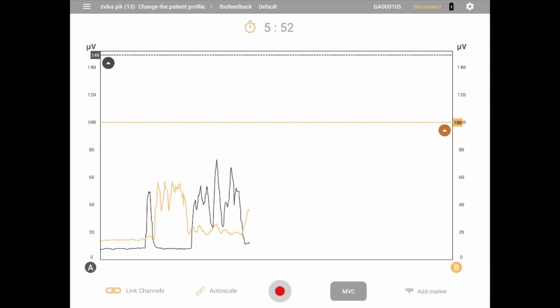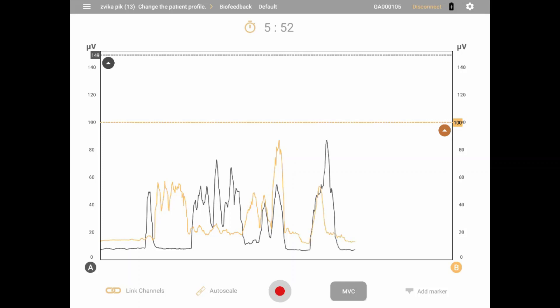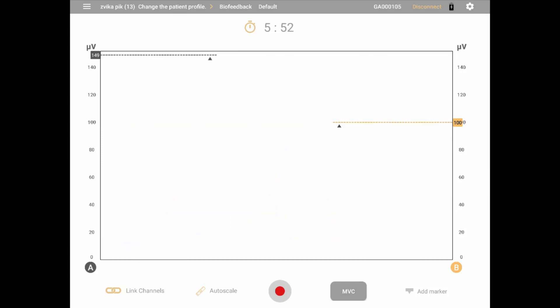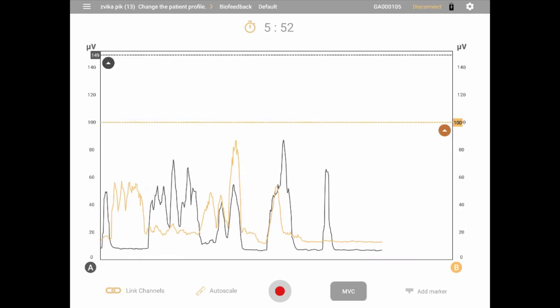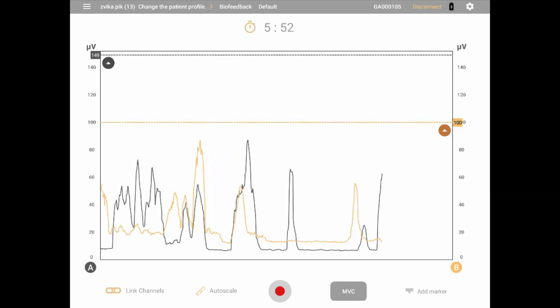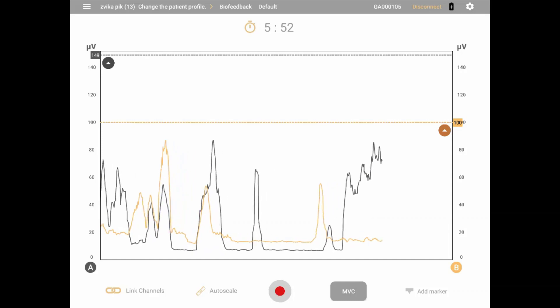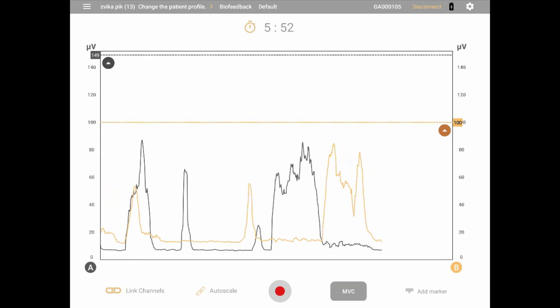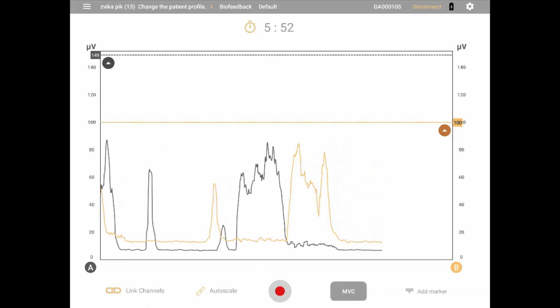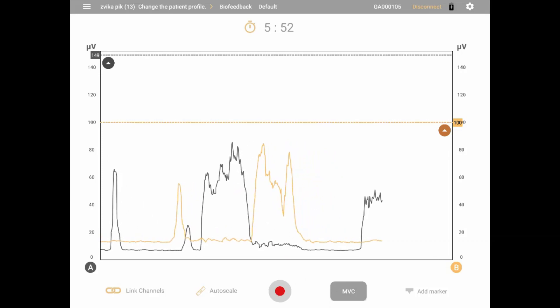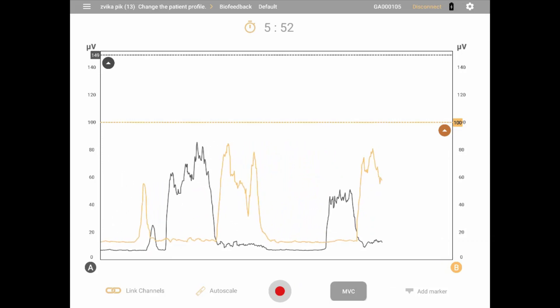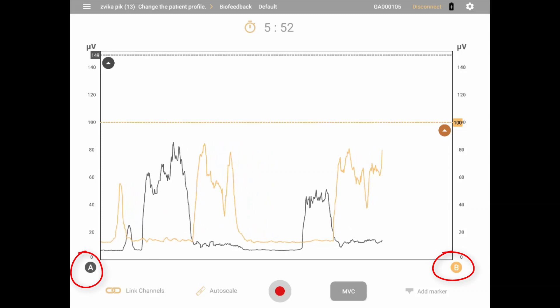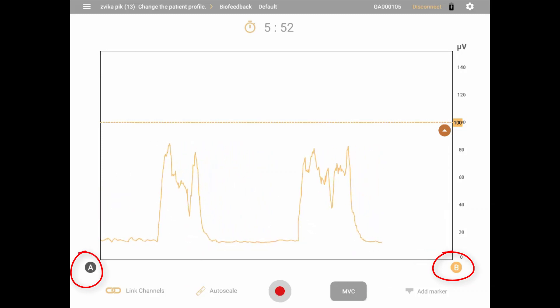The first view is a line graph consisting of time displayed on the x-axis and signal amplitude scaled on one or two y-axes. You may switch between different view types by swiping left and right anywhere on the screen. The left scale represents channel A and the right one channel B. The signal for channel A appears in black and channel B in gold. To hide or show the scales and signals, you may click on the letters A or B below the y-axis scales on each side.